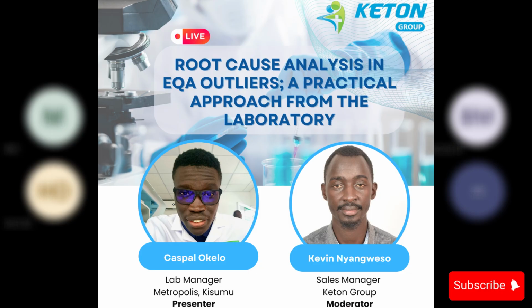Sarati is asking the difference between SDI and Z-score. Thank you very much, Sarati, for your question. SDI is the standard deviation index, and the Z-score; both measure how far a value is from the mean in terms of standard deviations, but they're used in different contexts. SDI is often used in quality control, and it compares your test result against the reference or target value.